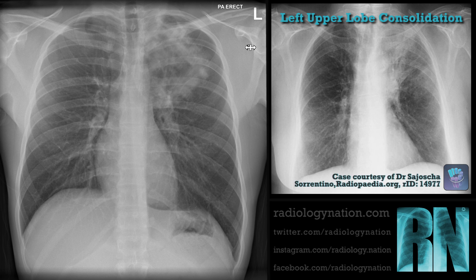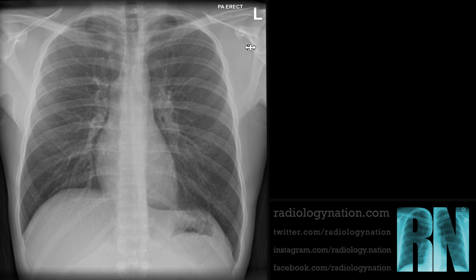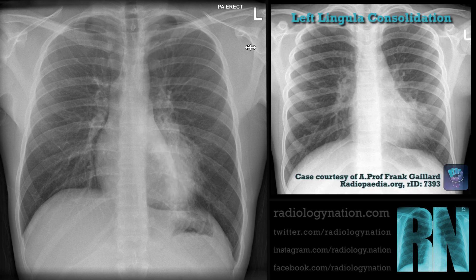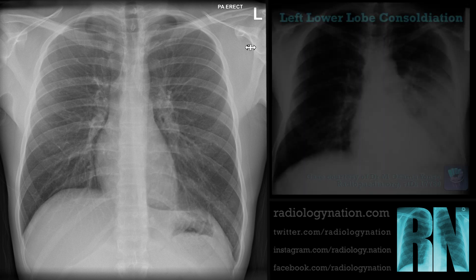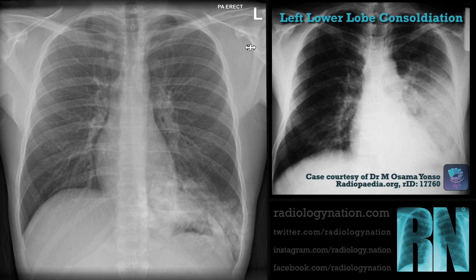Consolidation in the left upper lobe may present with loss of the left mediastinal contour and loss of the left heart border. The left lingula lies against the left ventricle, so consolidation in the lingula will obscure the left heart border. The left lower lobe is in contact with the left hemidiaphragm, so consolidation in this lobe may obscure the silhouette of the left hemidiaphragm while the left heart border will be preserved.